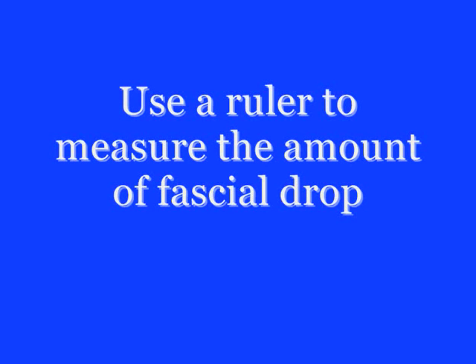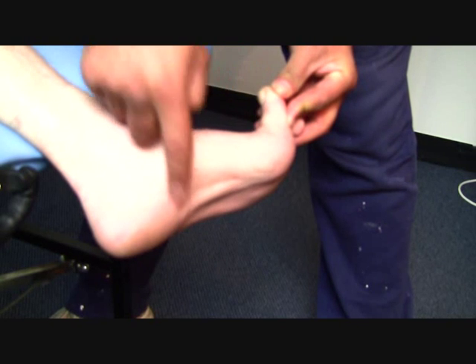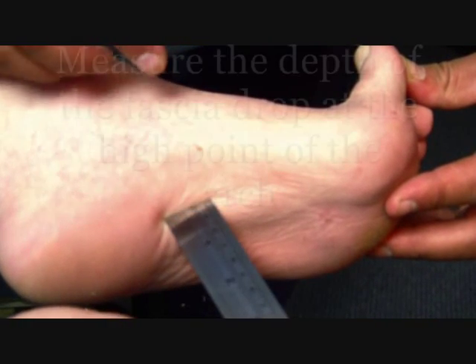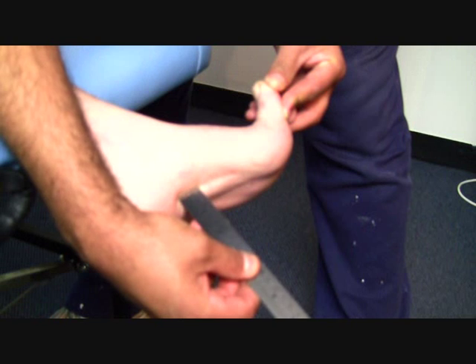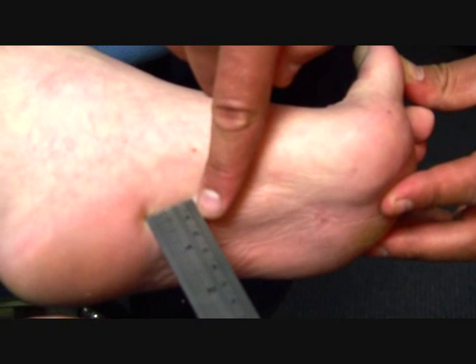Once you have dorsiflexed the hallux, you will need to measure the amount of drop. Find the highest point of the arch on the patient's foot and use a measuring instrument to measure the amount of drop at that highest point. In this instance, 7mm is the amount of plantar fascial drop.